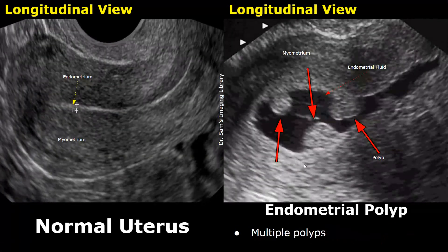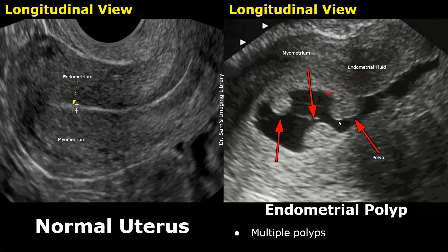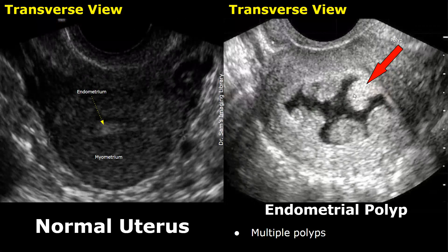Multiple polyps can also occur in some cases. In this image we can see four polyps in the endometrial cavity with a significant amount of endometrial fluid. This image in transverse plane also shows multiple polyps with endometrial fluid.